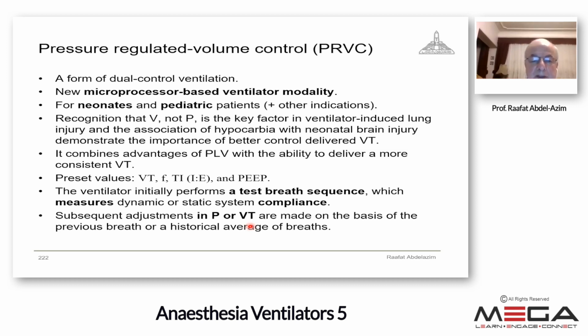So I adjust the ventilator settings for tidal volume, frequency, and inspiratory time. The tidal volume will be given and will be assured, but the pressure changes are first tested, and the flow will be adjusted by the ventilator to give the desired tidal volume without having hazard of increase or decrease.